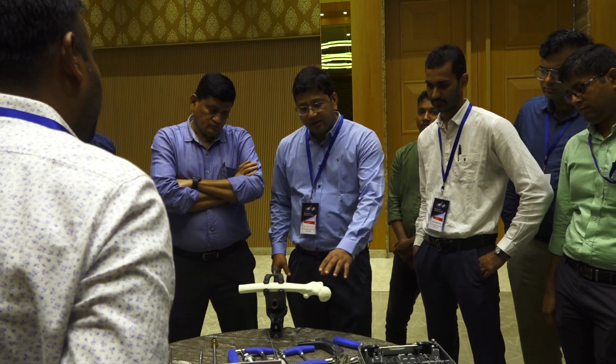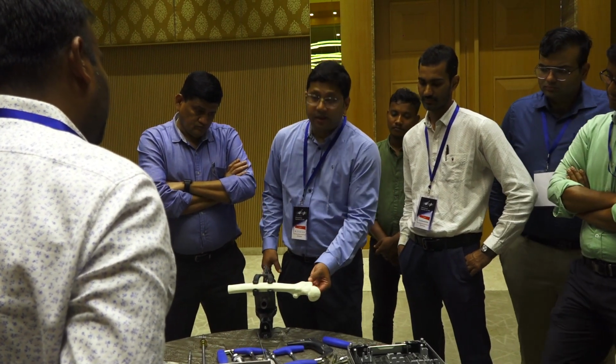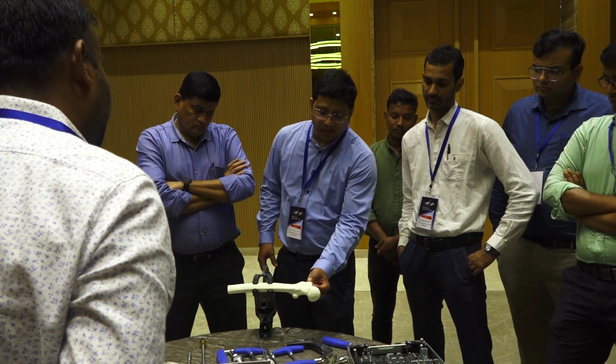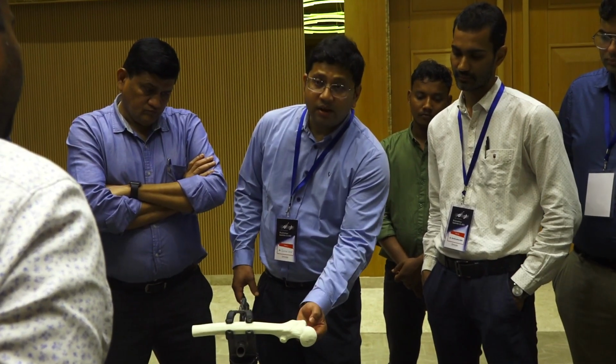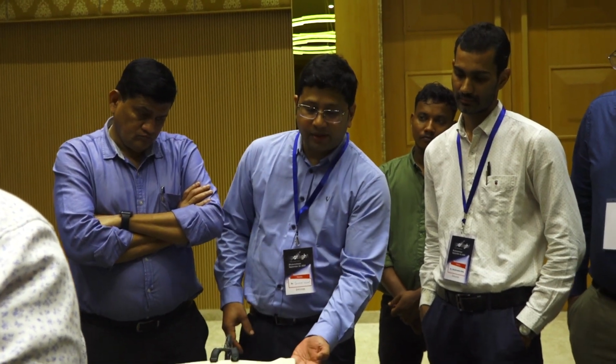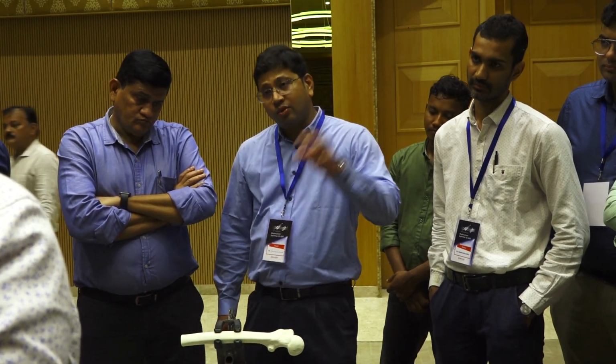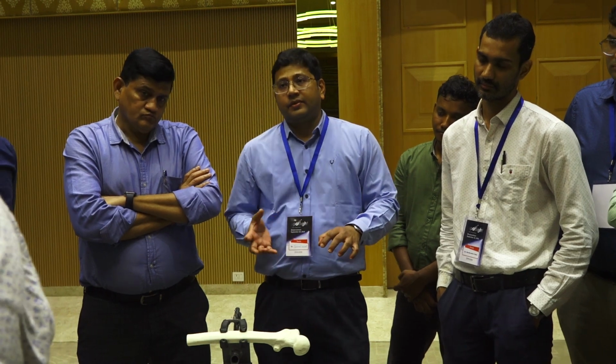So original reduction of everything, not only the neck and the shaft, but also the greater trochanter as well. Many times the greater trochanter as a whole is fractured and it is going posteriorly. So at that point, you had better reduce the GT provisionally and clamp it with a pointed reduction forceps, and then start the entry point so that the nail goes into the center of the GT and it holds the GT as well.